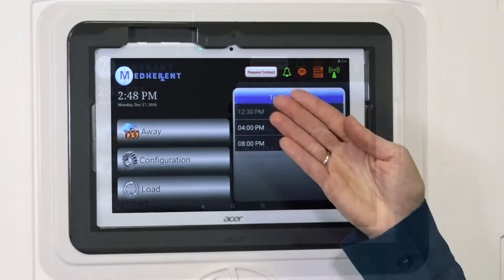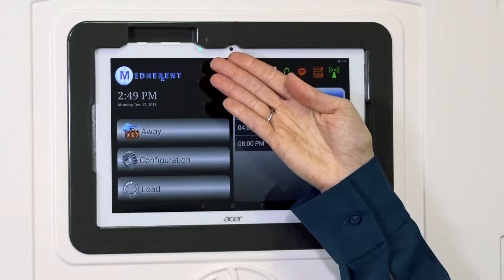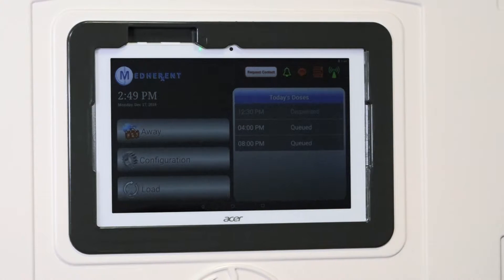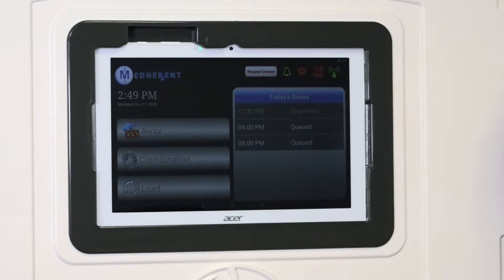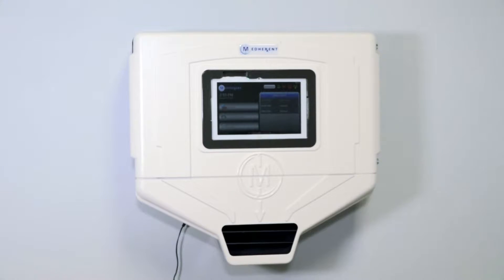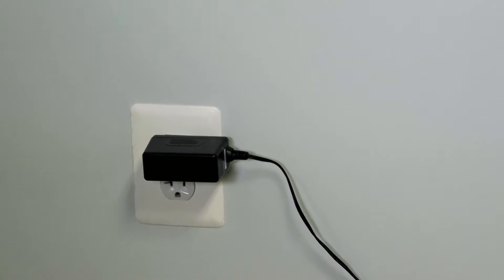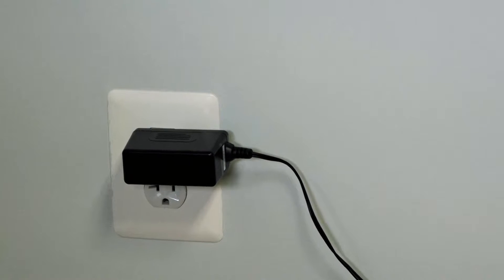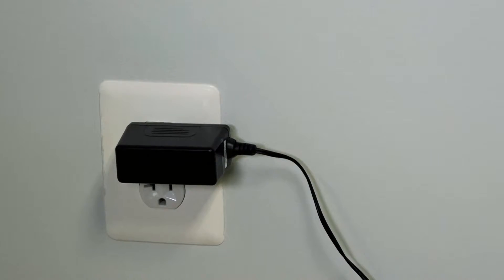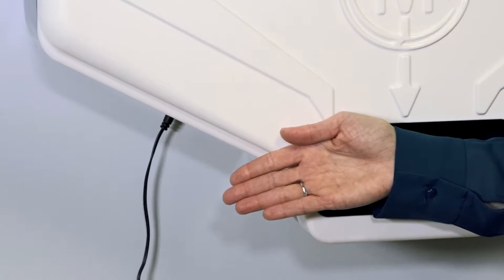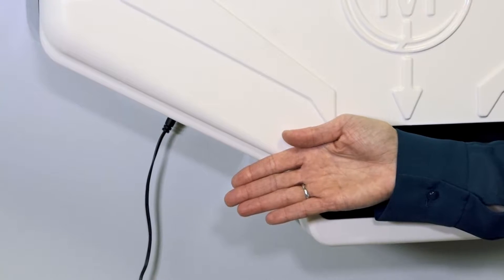When this indicator light is green, the machine is plugged in properly and thus not draining the backup battery. Please make sure that the Medherent machine remains plugged in at all times. Don't forget to ensure that the cord is plugged into both the wall outlet and the device itself.